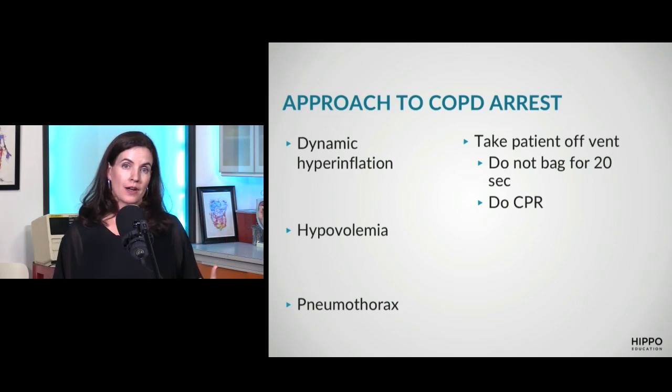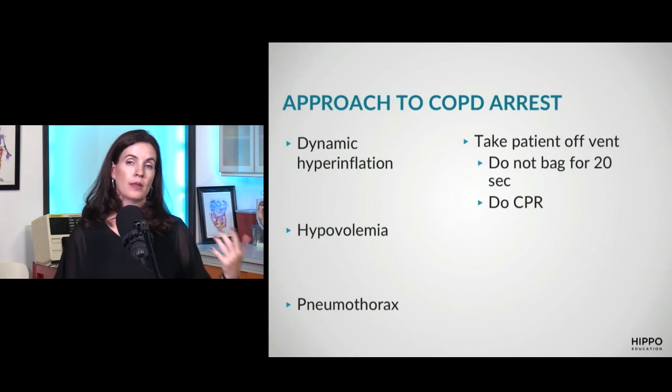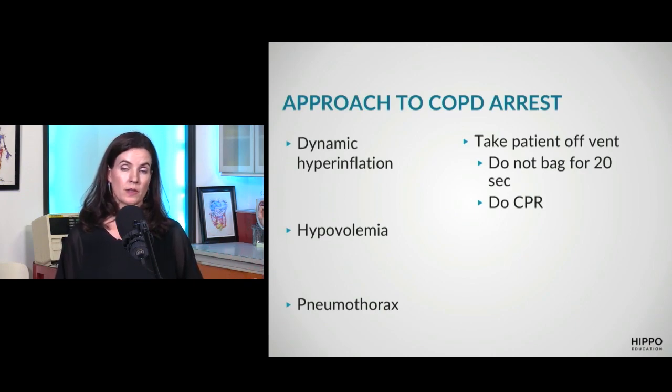Now, during this time, when they are disconnected and you're not bagging, we're doing CPR, which is pressing on the chest and actively helping them exhale. That 20 seconds with CPR is going to fully empty their lungs. And if the original problem was dynamic hyperinflation, they should rapidly get their preload back and they will get return of spontaneous circulation, often within that first cycle of CPR. So this is something that can be rapidly fixed by holding the bagging and making sure we're actively deflating the lungs.